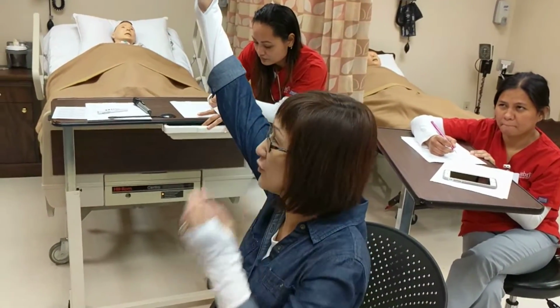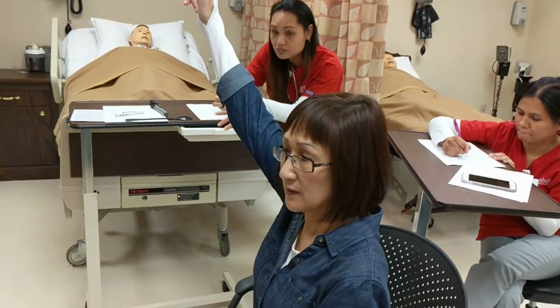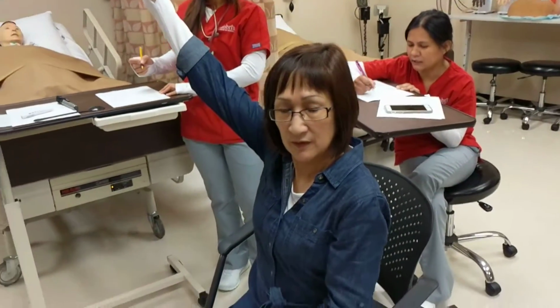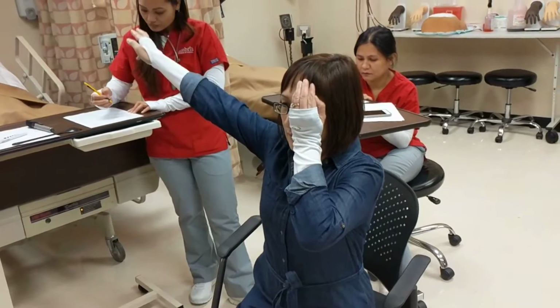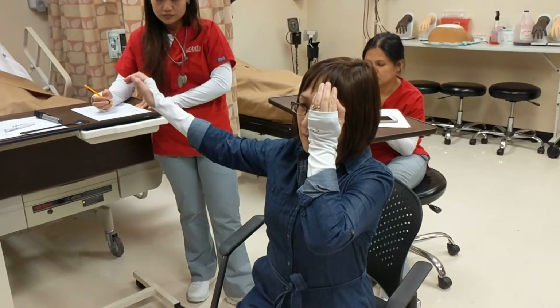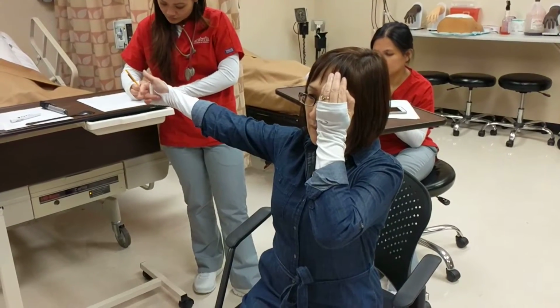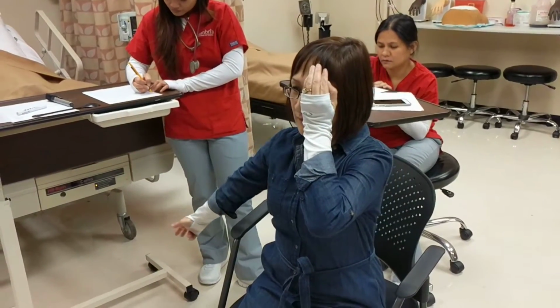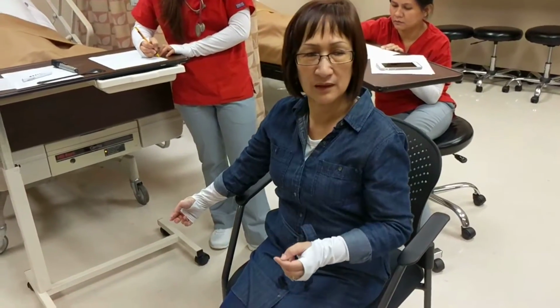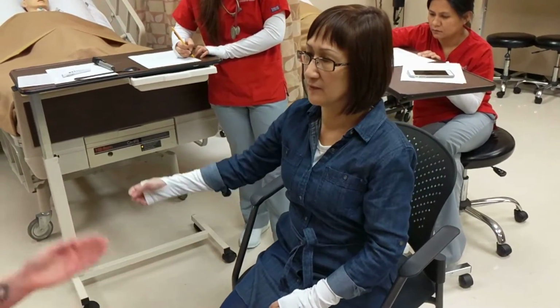Okay, so this is the superior field. And this would be, what is the angle? 50. Temporal, 90. Nasal, 60. Inferior, 70. Okay, now let's test the other eye.